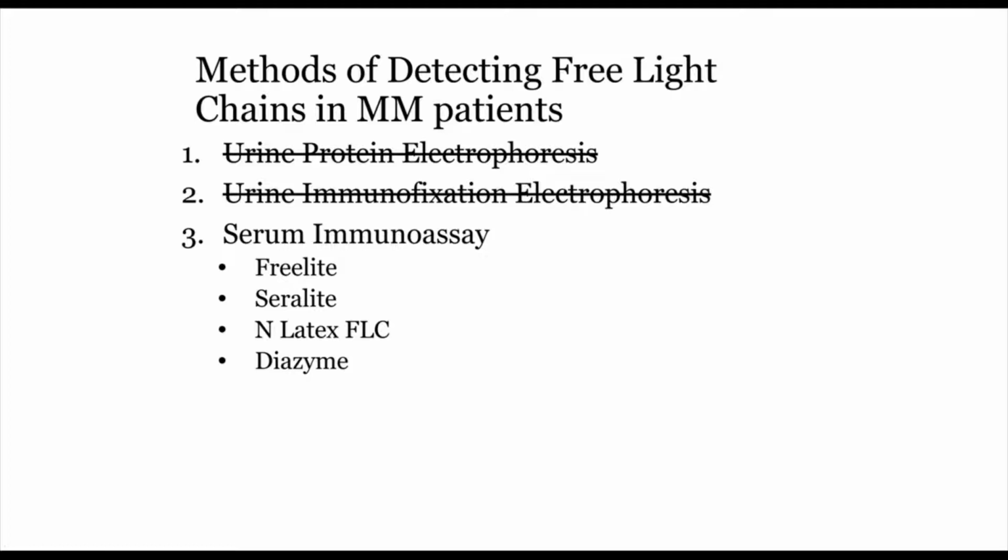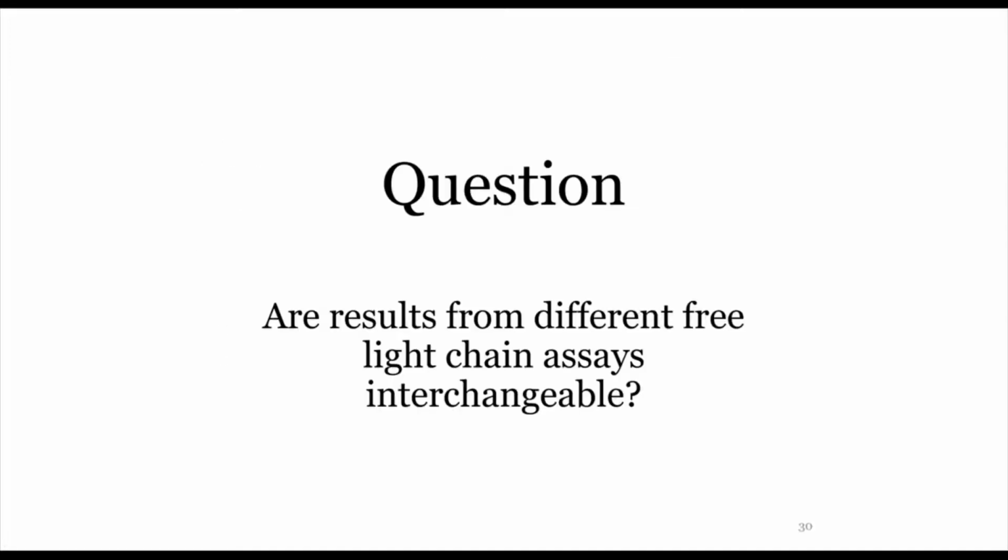These include the Freelite from the Binding Site, Seralite from Sebia, and latex free light chain from Siemens, and the kappa and lambda assays from Diazyme. Of these 4, 3 are FDA approved. So this begs the question, are results from different free light chain assays interchangeable?